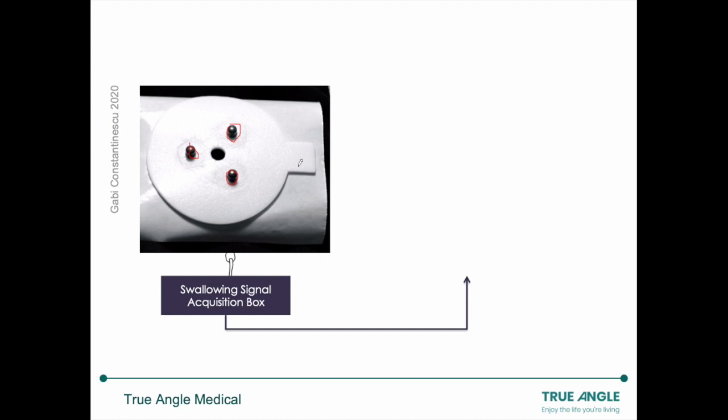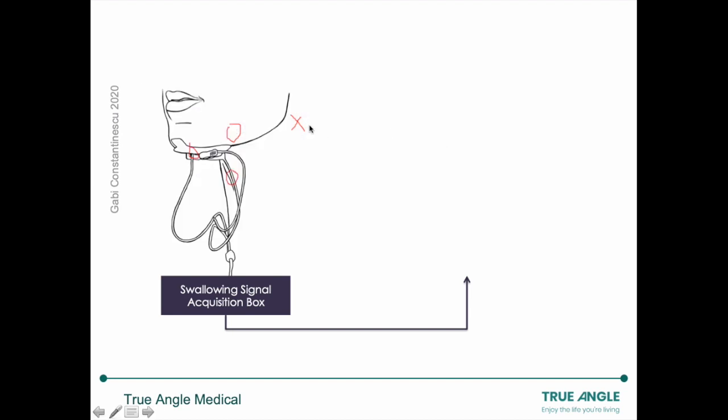So what happens is once you detach this sticker backing and attach the sensor sticker to the patient's chin, you will then use three alligator clips that connect these sensors and the information captured from them to the swallowing signal acquisition box.